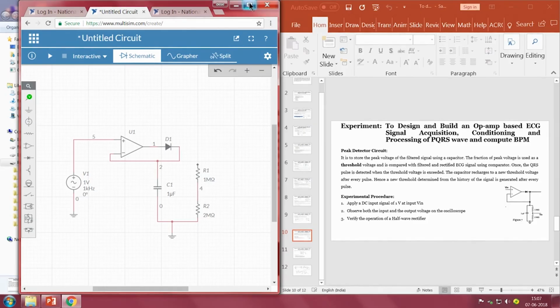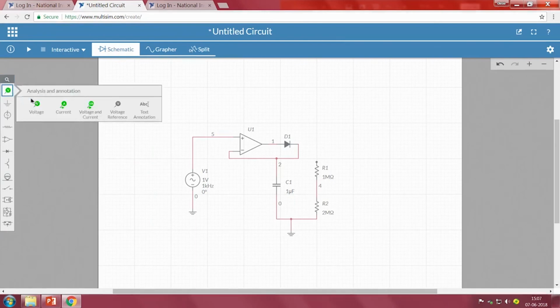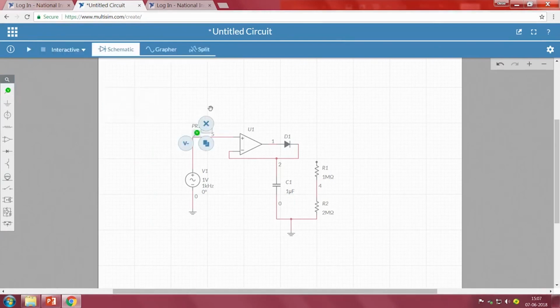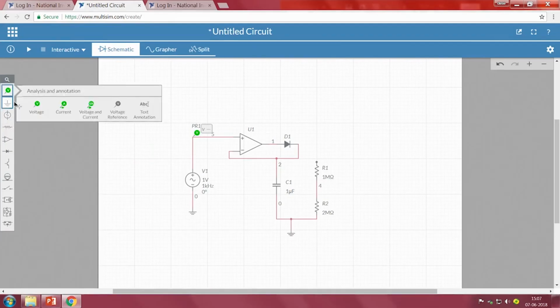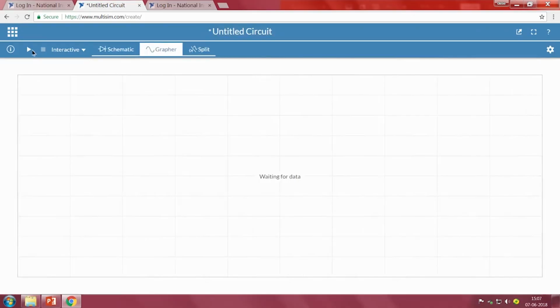So, whether it is giving the threshold of our requirement or not. Now, I will take two probes, one at the input, which measures the input voltage that we are connecting to the op amp positive terminal, and the other one at this particular point. The green represents our input and the blue represents our output of the op amp. Now, to understand the circuit, let me go to the graph and run it.